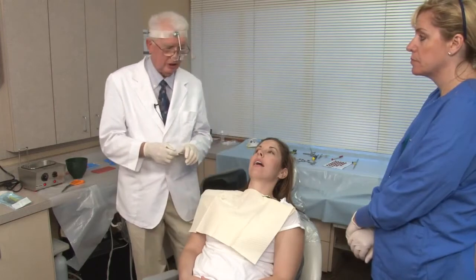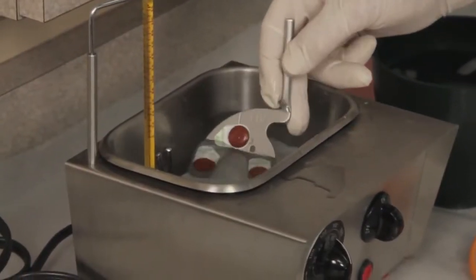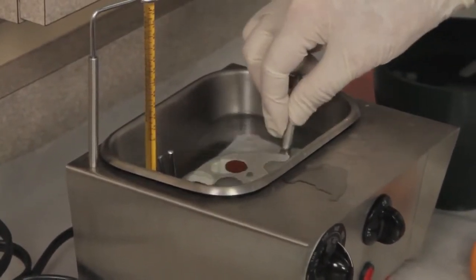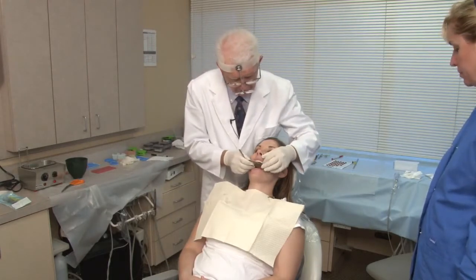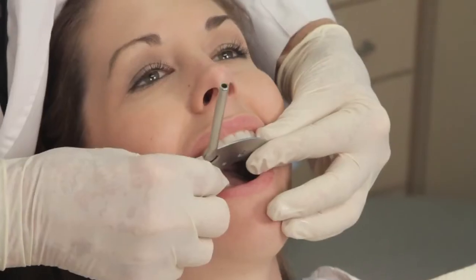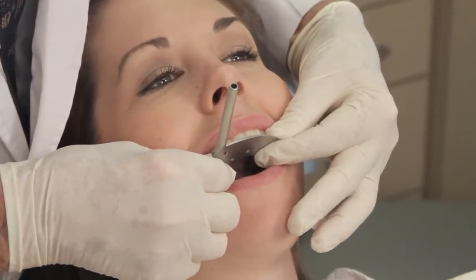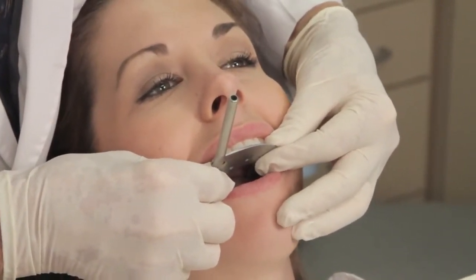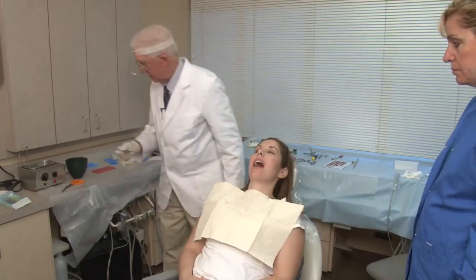So let's take one of the bite forks now. Okay. So first thing I have to do is soften it, and now I have to cool it all off and set the base of the compound. And then I will put it in ice water.